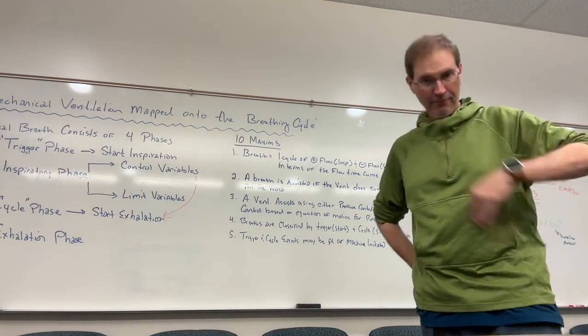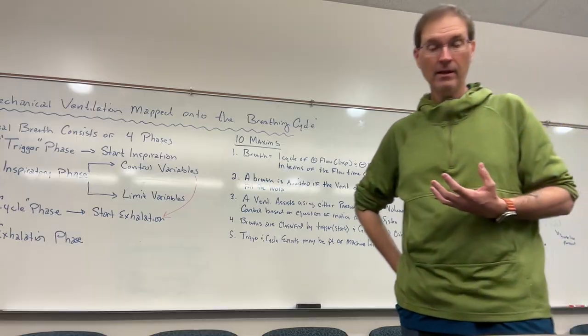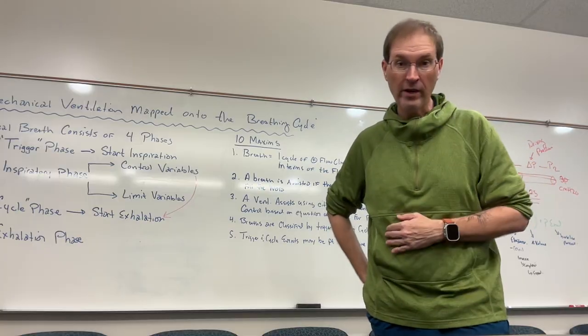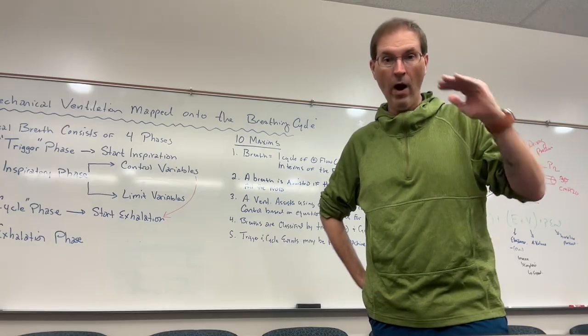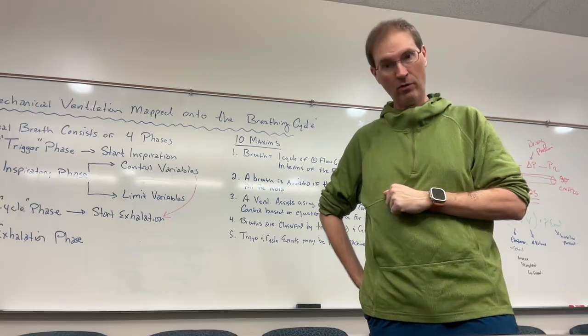If these events are entirely machine initiated, and that breath is machine initiated, this is often referred to as a mandatory breath. And that is a breath that is delivered. It is kind of like what the ventilator has to deliver at a minimum. That's a mandatory breath.